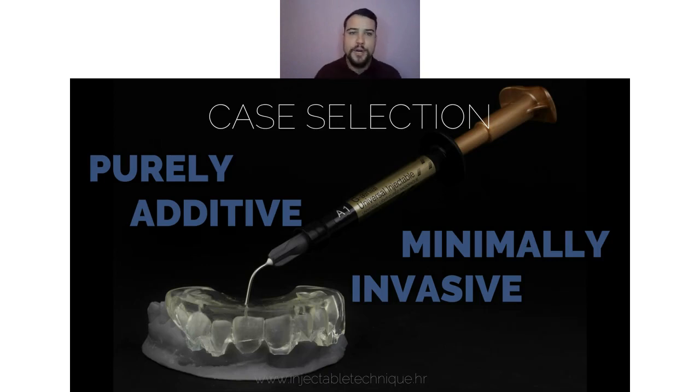We only add composite on top of the original dental morphology. So is it non-invasive or minimally invasive, depending on how we look at it? Because of course we're going to place the adhesive, and this is some kind of microscopic trauma for the tooth, and we cannot do it without touching the tooth. But compared to minimally invasive ceramic veneers with 0.3 to 0.6 preparation, this is much less invasive.